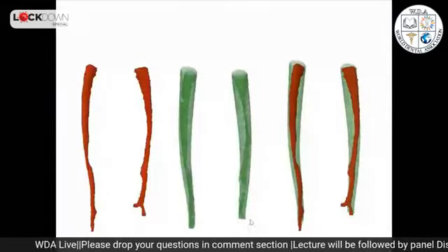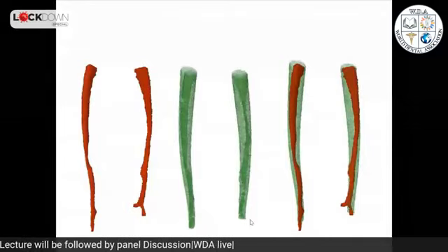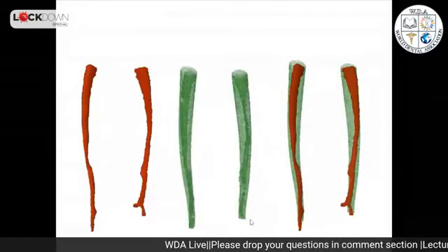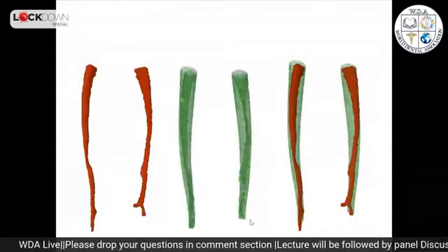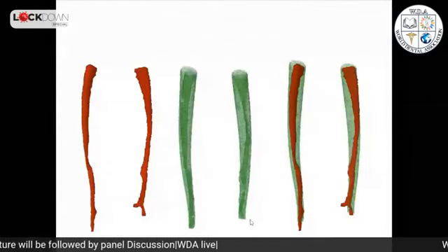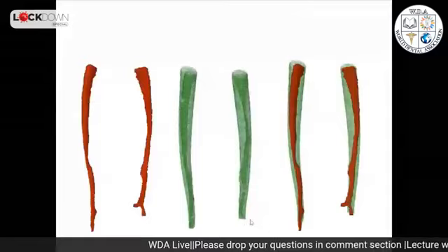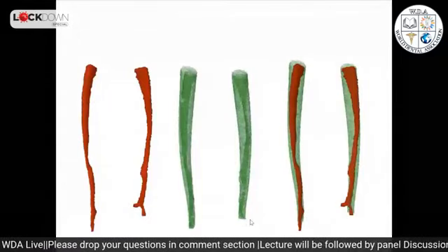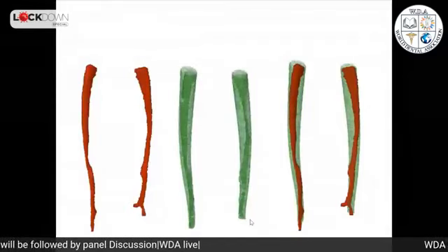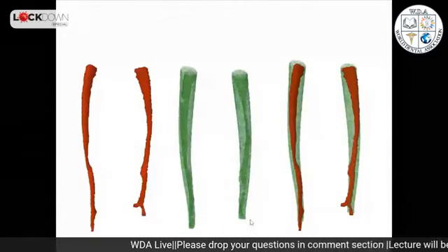And another variable that I would also like to talk about is the anatomy. Of course, you will find that a lot of dental companies are trying to improve the mechanical behavior to try to clean lateral anatomy. So basically, you can see here a mesial root of a mandibular molar. We can observe in red the preoperative root canal before the instrumentation, and then you can see in green after the instrumentation.